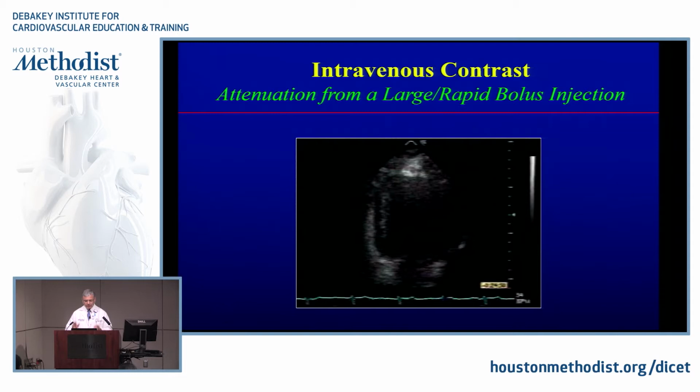Now, when you inject, most agents, although the actual package insert doesn't tell you to dilute it with a certain number, most places in the country and beyond dilute these contrast agents to about 10 cc or so, to make the bolus not too concentrated, to avoid giving you too much attenuation.